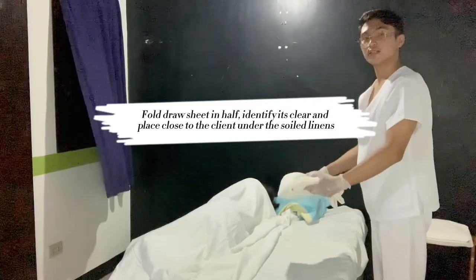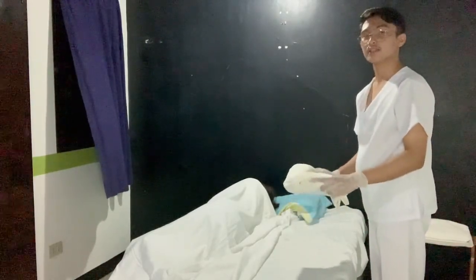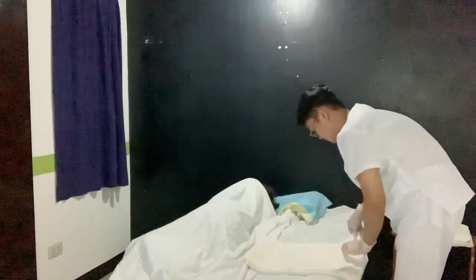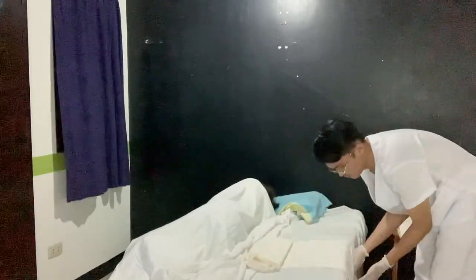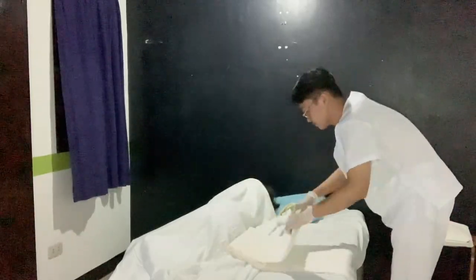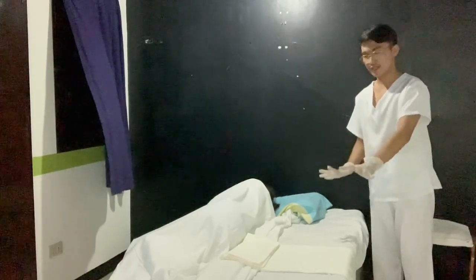Put it in the middle of the bottom linens, make a fan fold and tuck it under the mattress. Now we have already put the bottom linen and the draw sheet on the side of the bed.